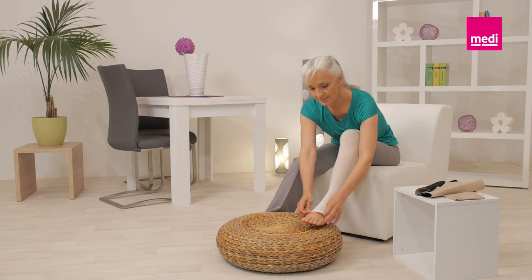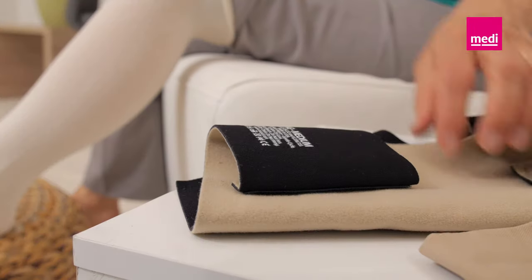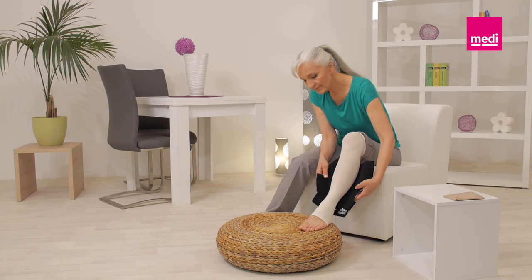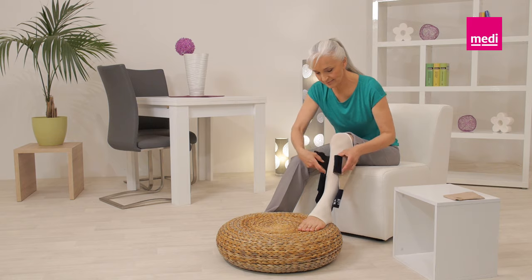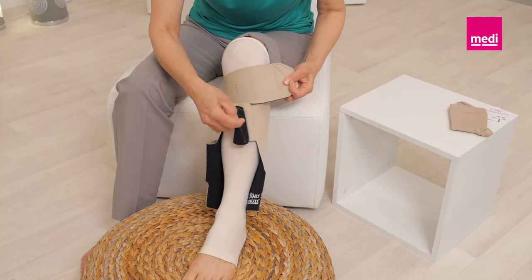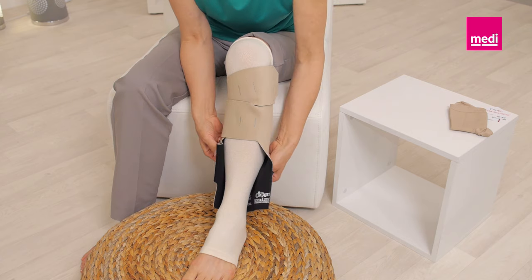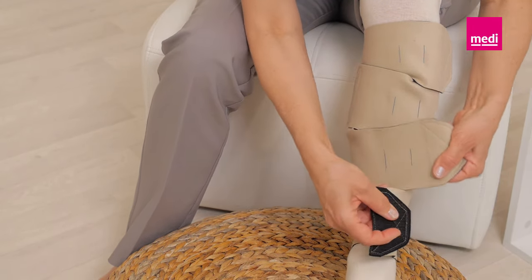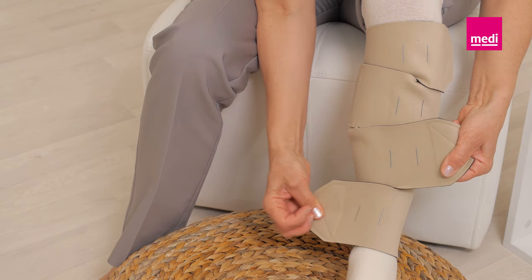Align the circade juxtalite lower leg just above the ankle bone and below the knee crease. The black side of the material should face the skin. Unroll the top two bands and loosely secure them to the outside of the garment to anchor the legging in place. This enables you to easily raise or lower the garment for correct positioning.